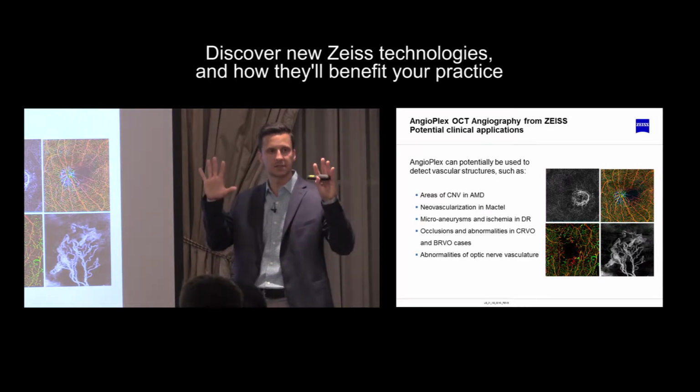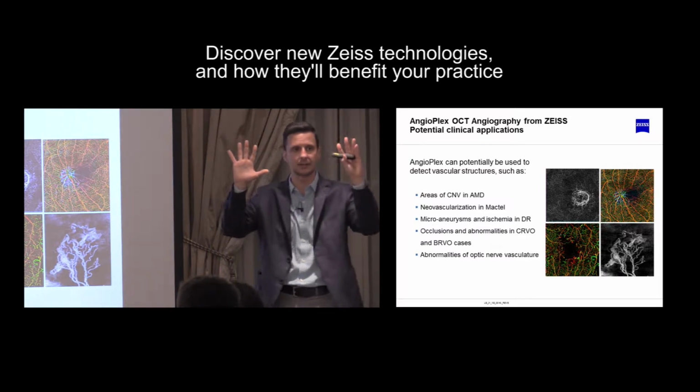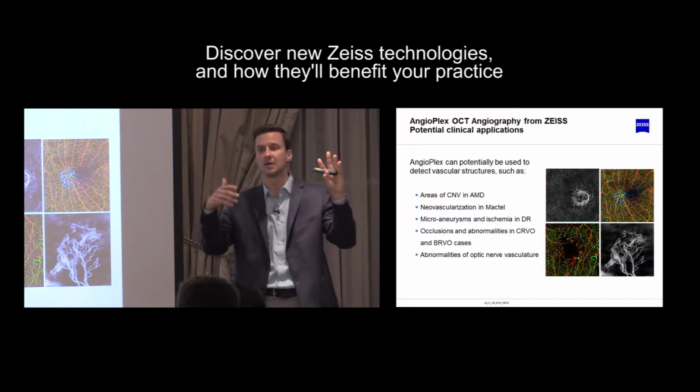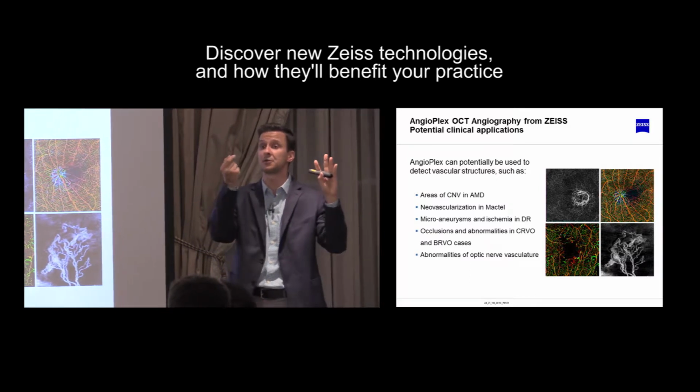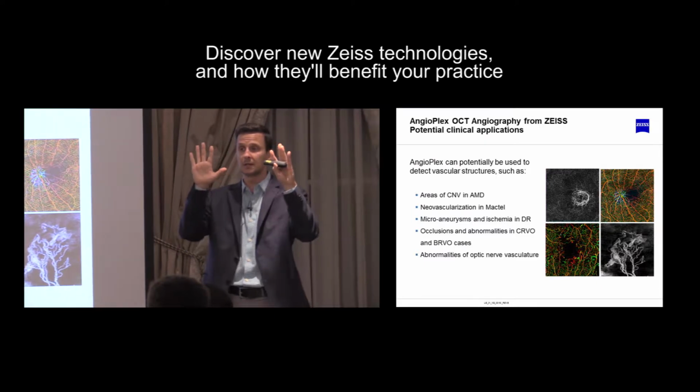And when he was in for the visit, we had both of his nerves up side by side. And we were looking at the two nerves side by side and said, there just looks to be a little bit of difference in the perfusion. We weren't looking at the colorized images. This was just looking at what looked like the density of the vessels. And there are new tools that are coming out to measure the density of the vessels, which can give you comparative analysis over time.